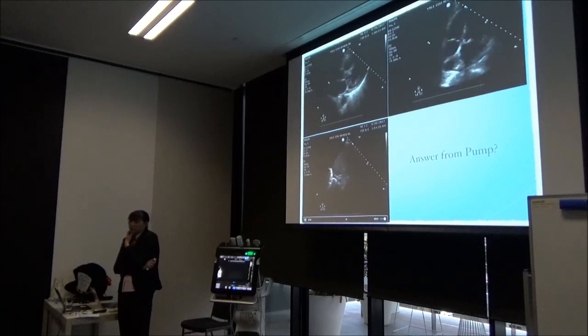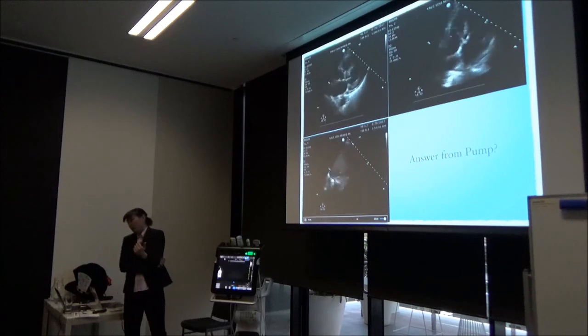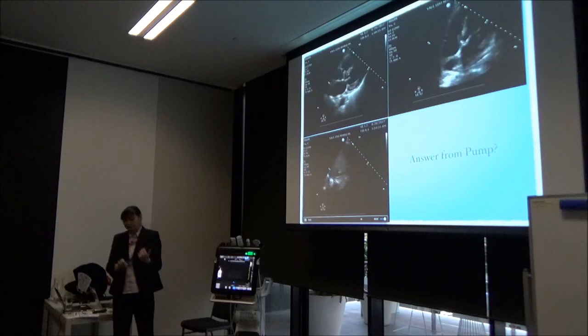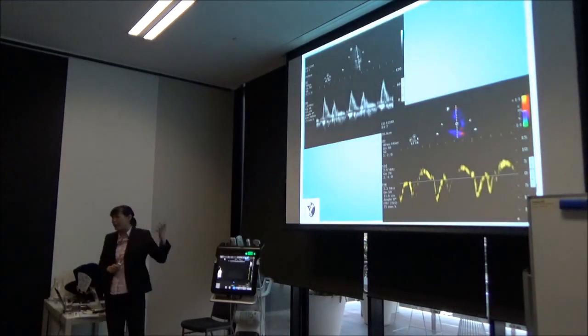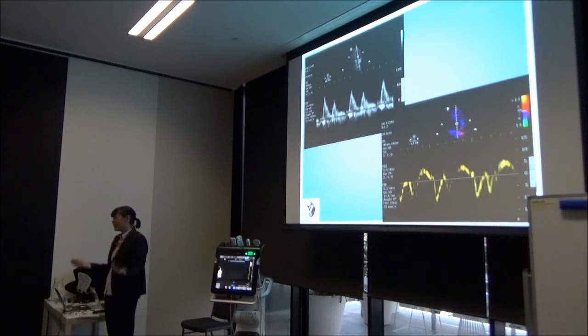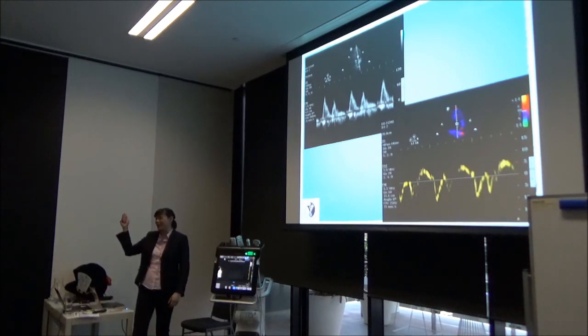So what pathologies can we rule out automatically? It's unlikely to be decompensated systolic heart failure, but they have given Lasix, so that's not going to help our cause here. The echo looked pretty normal, so then we even did a diastolic assessment to see if she had diastolic heart failure, which I will just say these are normal. I can show you in the hands-on stuff, but this is normal.